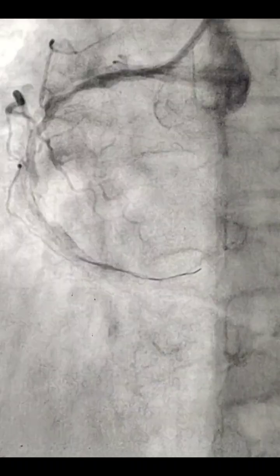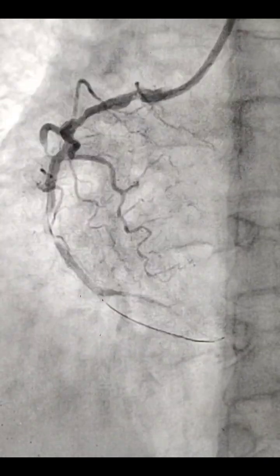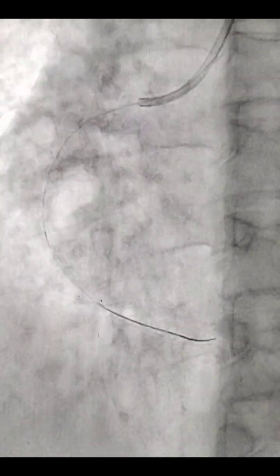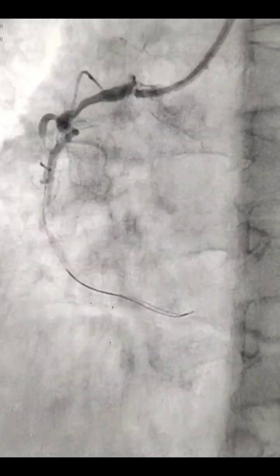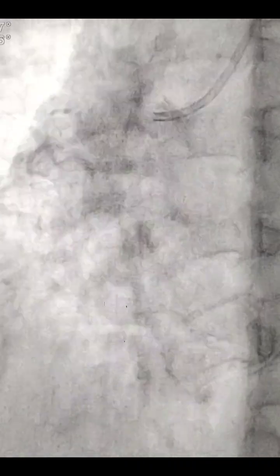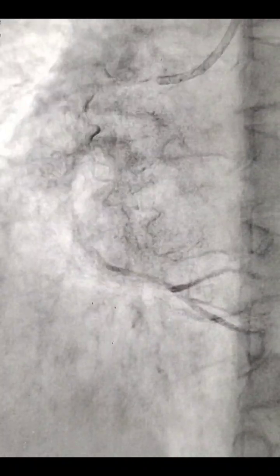So I wanted to remove this wire and place the wire in some bigger vessel, either the PDA or PLV. I tried and I negotiated. After this, I have given tirofiban, nicorandil and everything, but flow is like that only. You can see the probable place of plaque rupture in the mid RCA. There's a thrombotic vessel right from the proximal RCA.